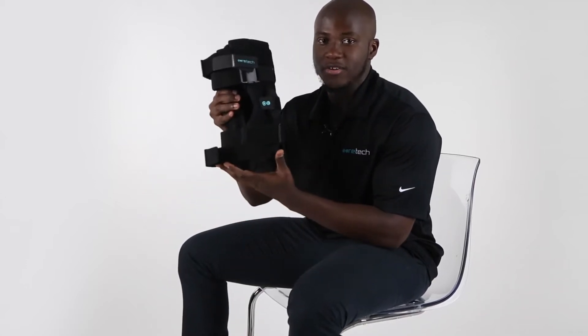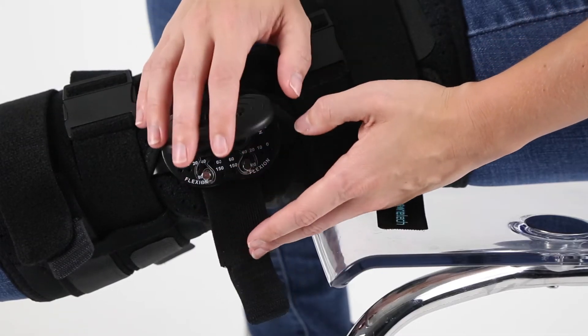The CoreTech 833 Knee Brace offers support for knee injuries such as MCL and ACL tears, strains, and sprains, while also reducing the risk of re-injury.